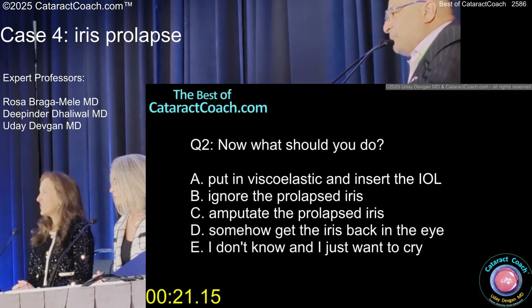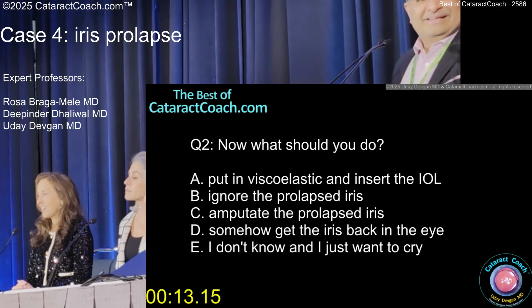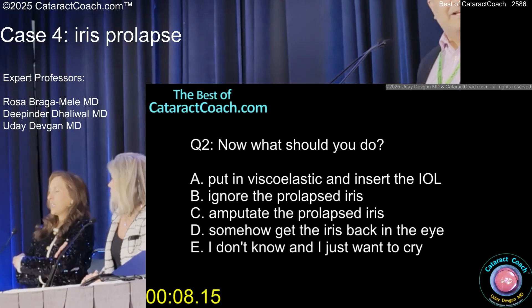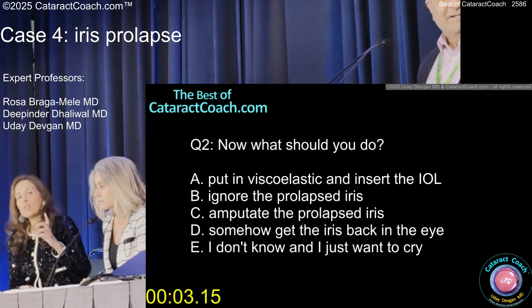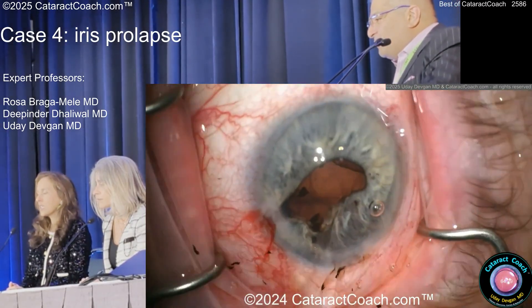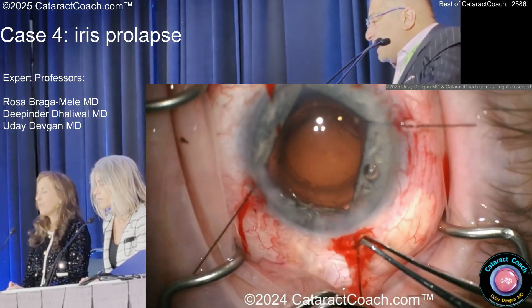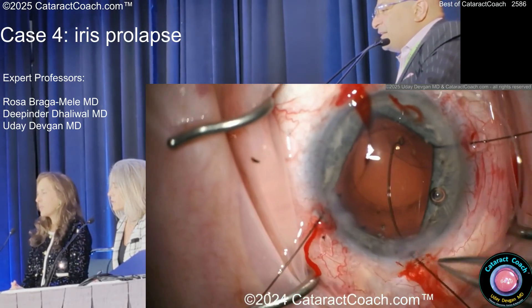You're not going to ignore the prolapse — just somehow get it back in there. We're going to get the iris back inside the eye; we don't want to amputate it. We've got to figure out what's going on with the bag — is there enough stability? Here are the hooks, including the sub-incisional. That's the most important one, the sub-incisional. Now it looks like the zonules are okay. Here comes the CTR.